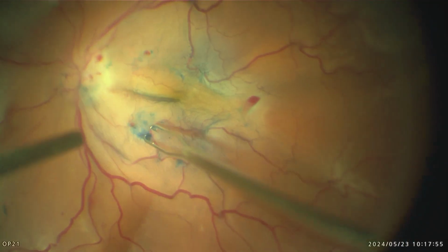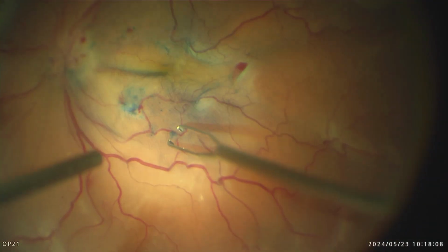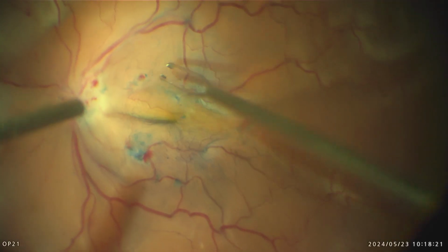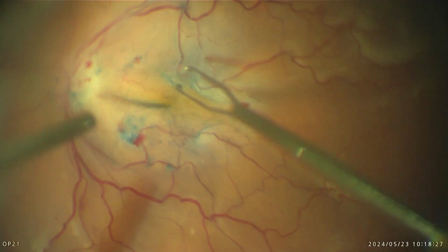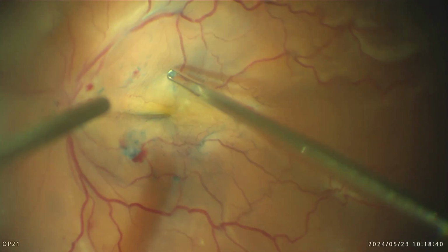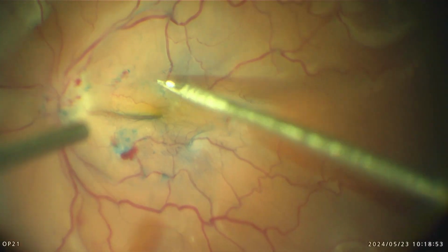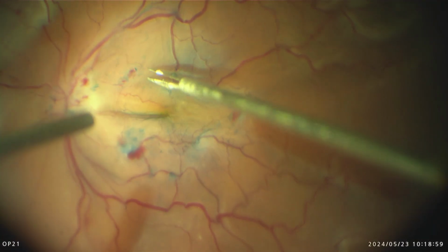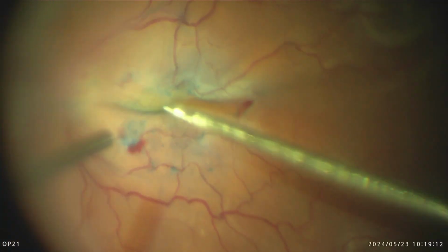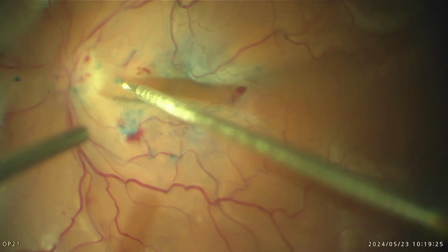And as I mentioned here, there's a surprisingly little amount of epiretinal PVR, which you would expect at least some degree of. And so in this case, I've actually stained this several times because I was convinced there should be at least some thick ILM over the macula, but here there barely was any ILM, and that fold over the macula is just from chronicity and most likely a lot of edema.